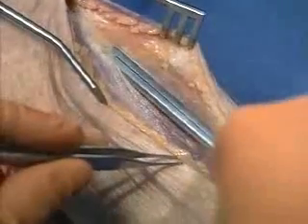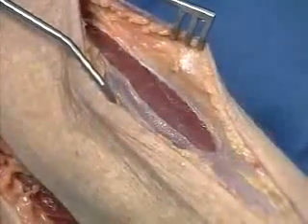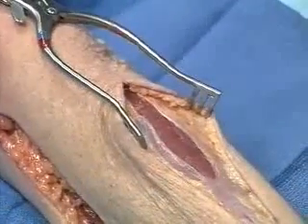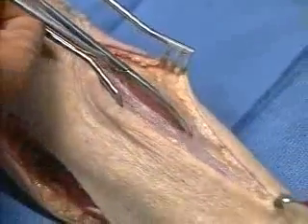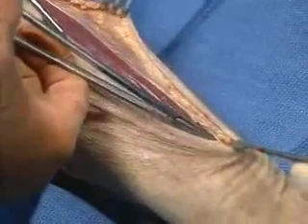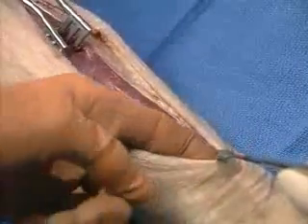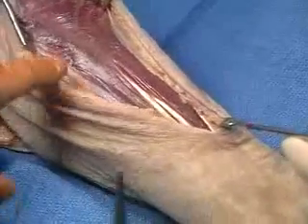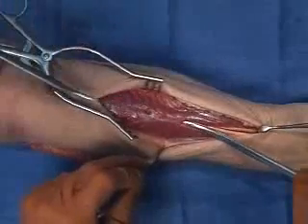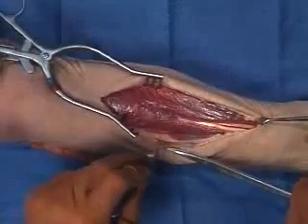We want to ensure that this fascial release goes all the way to the origin of the muscle. You can check it digitally with your finger. Distally, you want to stop just before the wrist and try not to release the extensor retinaculum of the wrist unless the clinical situation requires you to go farther. And to a lesser extent compared to the anterior compartment, you want to explore the individual muscles, and you may need to release some of the individual muscle fascia.